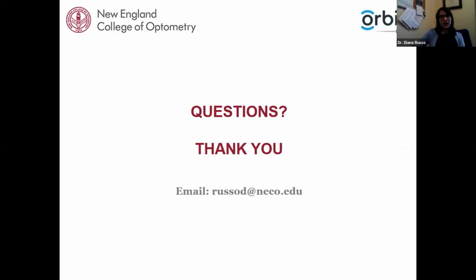How much time do you take for refraction? So this depends on a few things. The age of the patient, if the patient has been to the eye doctor before, if I speak the same language as the patient. If they're brand new to having an eye exam, everything will take a little bit longer. I will explain things a little bit more so that they understand what's happening.